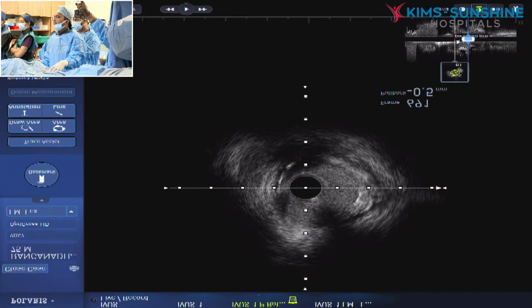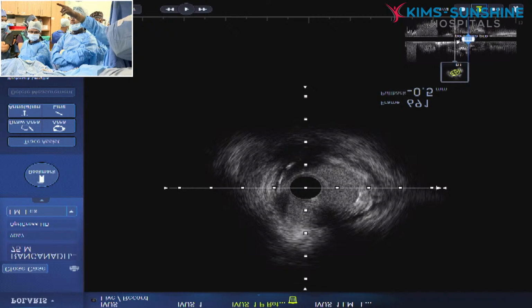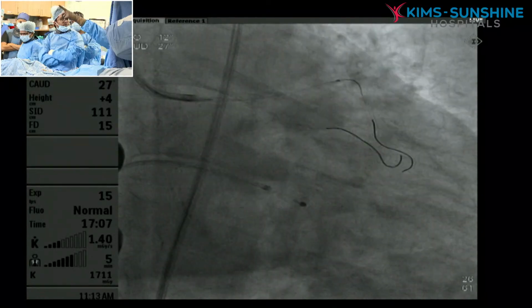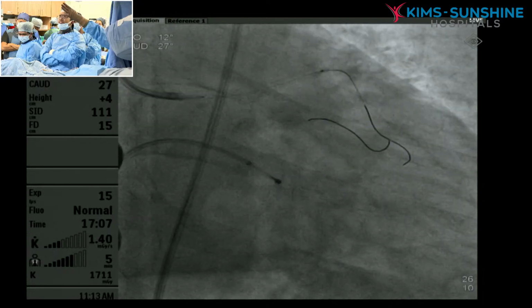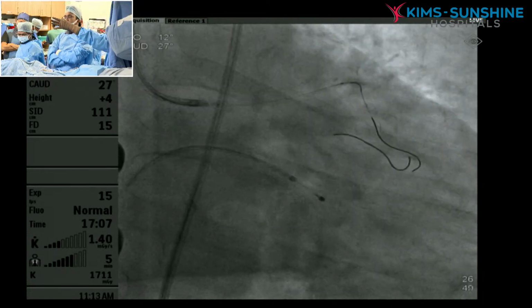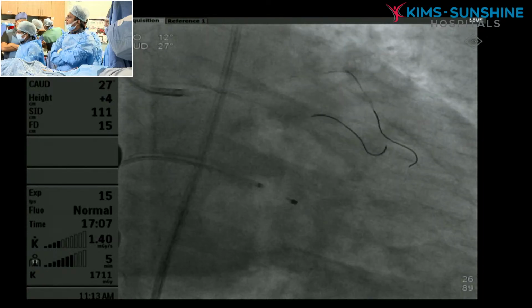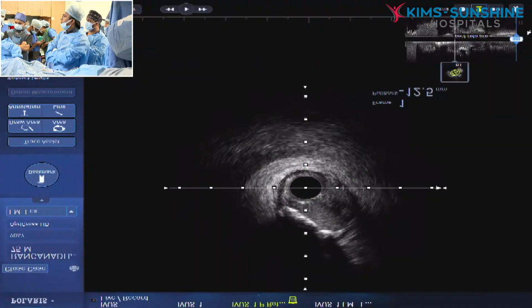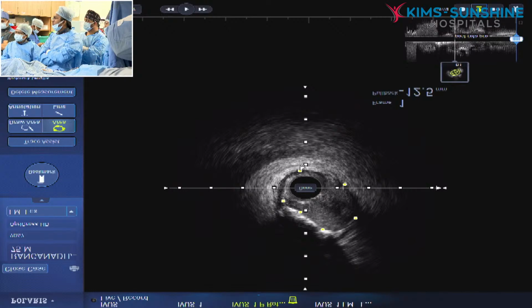If that is the case, you have to take the long stent and one more stent from left main to LCX. But I feel we'll extend only to the proximal LCX. Distally leave it. Otherwise, you take. But even if you take 3.8, it may not be sufficient. Distal, it may be larger. Lastly, go to the distal and see the area there. There will not be more than 2.5. A 2.5 will not go up to 4.5.